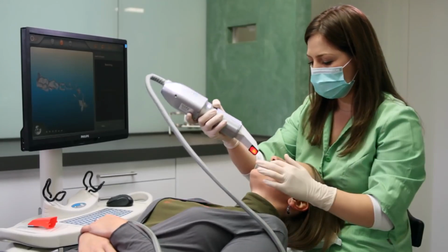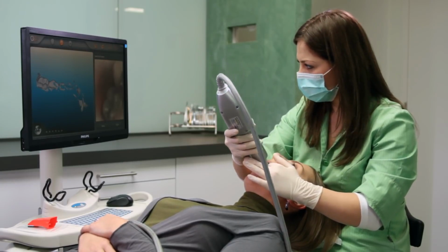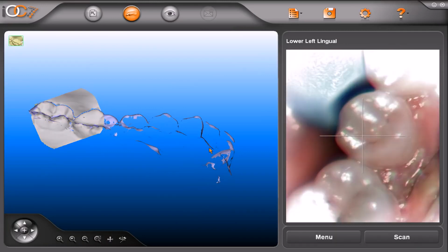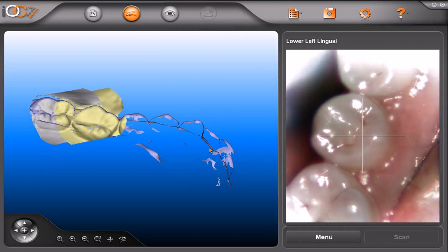The next segment is the lower left quadrant on the lingual side. Start with the most distal molar. As you move forward in the mouth, angle the scanner slightly, being sure to focus on the interproximal areas.